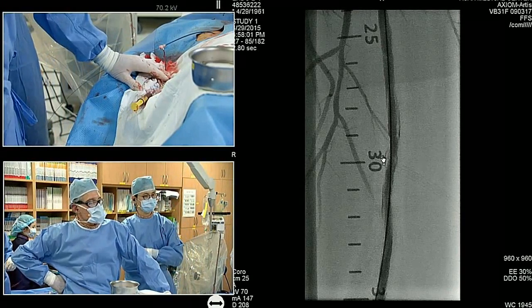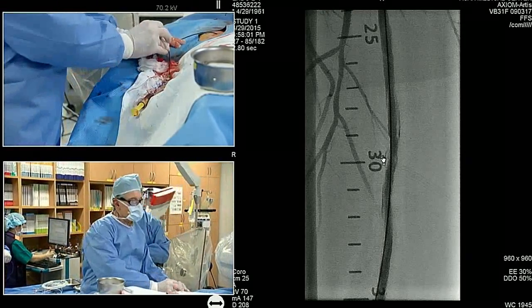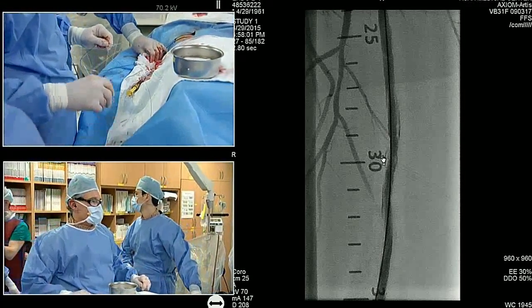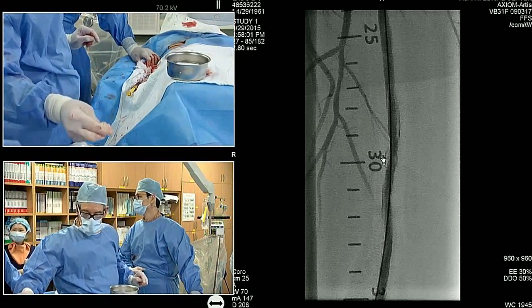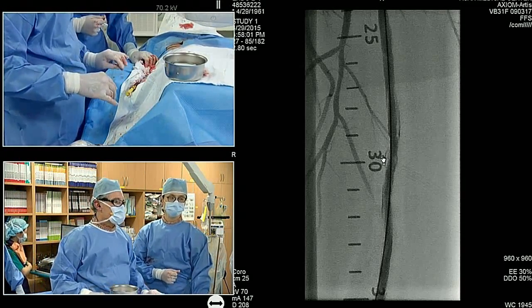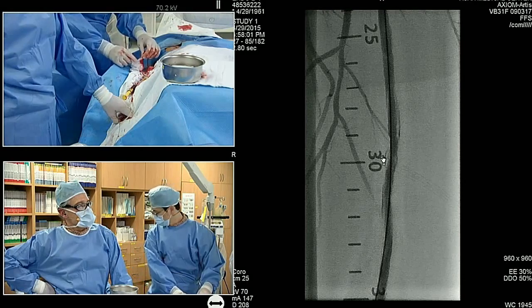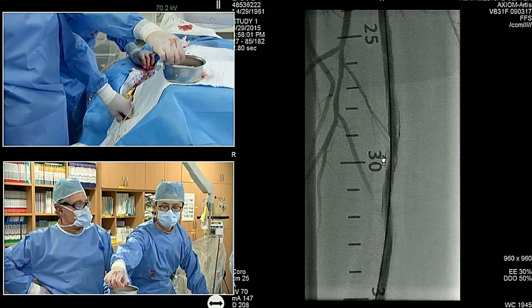What's the vote? So, what do you think? So, everybody wants to talk. Well, it's a tough call, huh? This is an area that was treated with the DCB, and it's a longitudinal dissection that does not affect the blood flow. So I would actually leave it, because we've learned that after DCB, these longitudinal dissections can heal. I was tending to think the same thing because flow is so good. And it looks more adventitial than luminal.